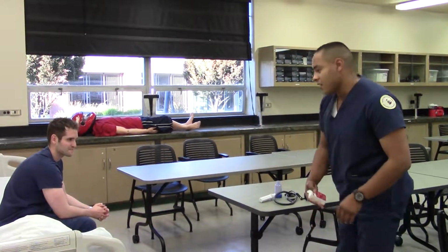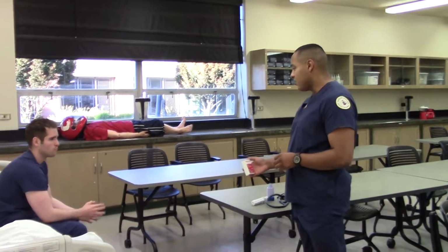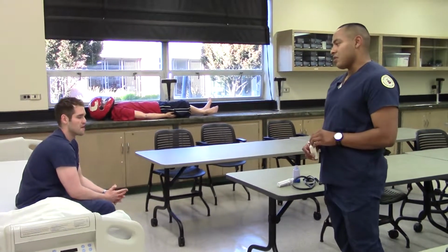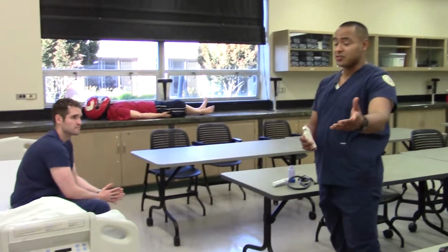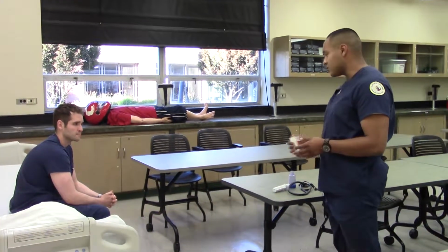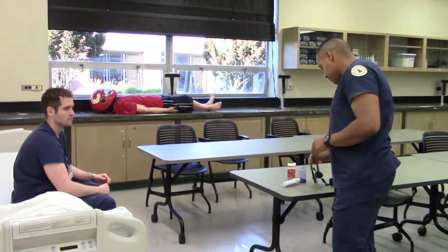Okay, cool. All right, so albuterol. Before we start, have you taken albuterol before? Back in the day when I was younger. Oh, back in the day when you had asthma? Yeah. Cool. So that's probably in the chart too. Okay, cool. I'm going to start with vital signs, okay? You can tell the patient, so vital signs is fine. You can start with vital signs.